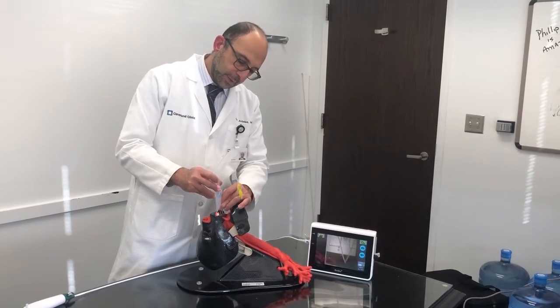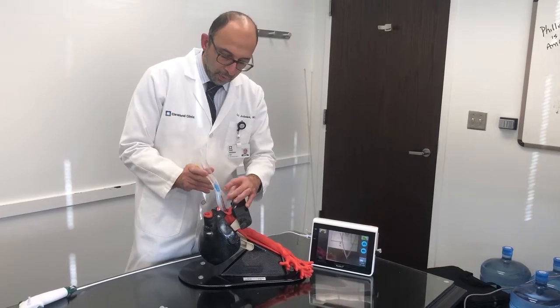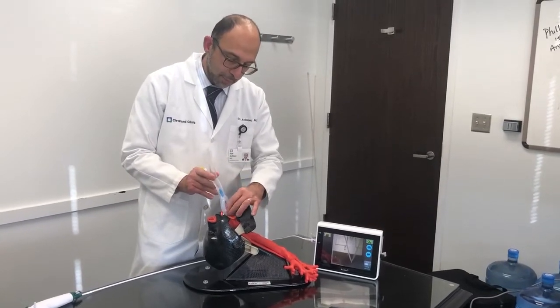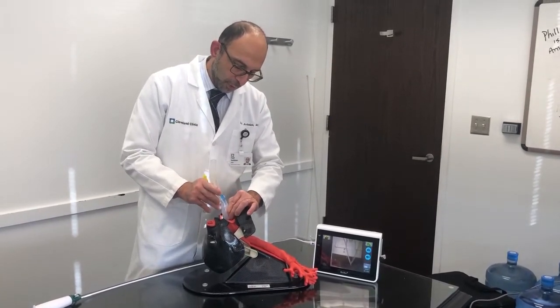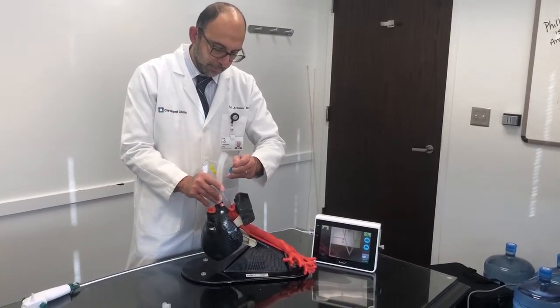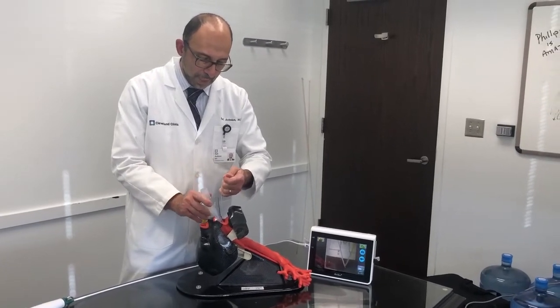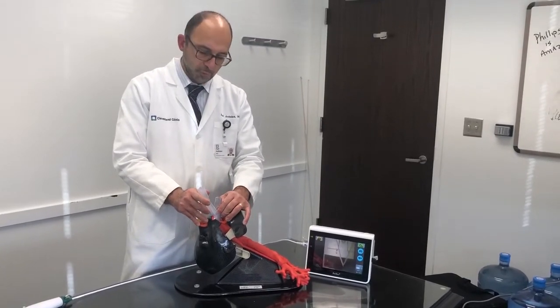Now, the opening of the AZ airway makes it possible for us to grab the endotracheal tube and place the supraglottic portion of the AZ airway behind the endotracheal tube without removing it.